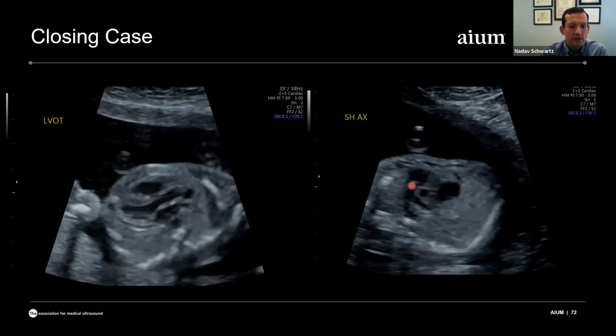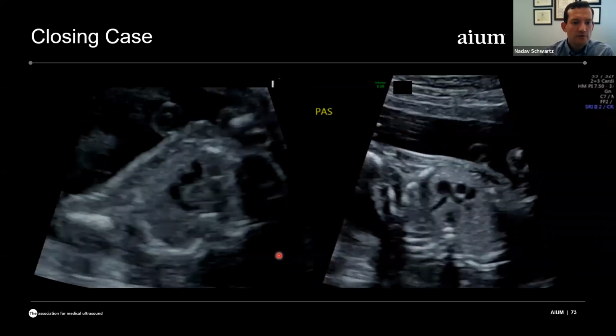On the right outflow tract, we see a little piece of the pulmonary valve over here, and the bifurcation with the ductus, as well as the branch pulmonary artery, and a cross section of the aorta over here, all looking normal and unremarkable. Moving up in the mediastinum, though, here's your 3-vessel view. And I wouldn't say this is the most overtly abnormal 3-vessel view, but let's talk it through.